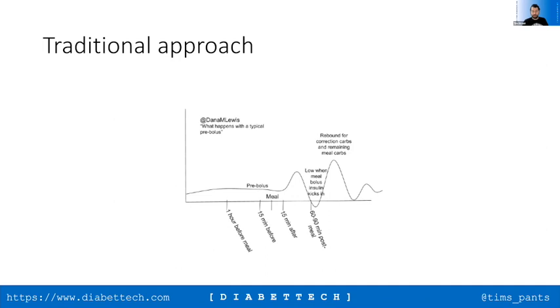various technologies, a problem. And so what I've done here is I've stolen a picture from Dana that's quite a useful one to look at. It's quite a typical pattern that people see with meals, as somebody's mentioned in the chat, in fact. Often what people will do using the faster acting insulins, this is a graph from a Humalog user, for example, is you'll pre-bolus before a meal in order to make sure that you time your insulin to the glucose rise. You'll get the timing wrong, and then potentially you'll go low or be heading low 60 to 90 minutes after a meal. You'll feed the low, and then you'll rebound all over the place, and you get this rather unpleasant sine curve in your glucose levels caused by things not working quite how you thought they would.